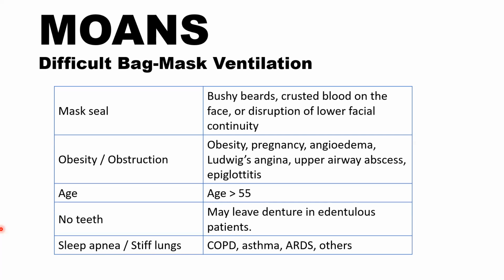So kalau untuk yang age tu selalunya macam elderly kan, nampak dia dah sagging. So another method you boleh just cepung tarikkan, macam buat facial, tarikkan. So untuk sealkan tu lah. Bawa pipi dia ke tepi the edge of the mask, ke atas. Ke atas macam.